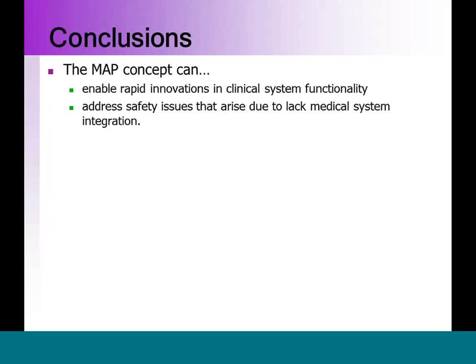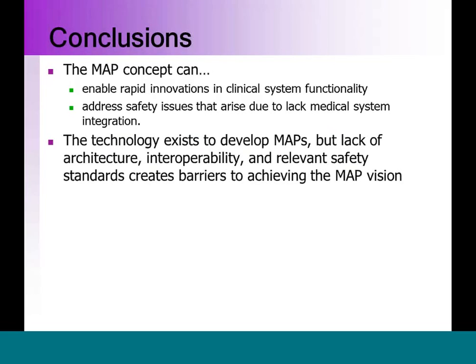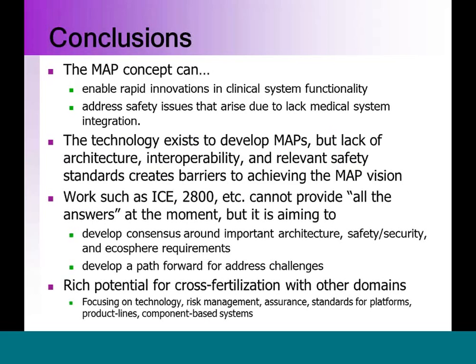But I'll just wrap up at the moment by saying what we're aiming for here is this medical application platform concept that can enable rapid innovations in clinical system functionality. You don't have to build new hardware. You don't have to come up with new displays for your hardware. Logically, you just develop your application logic as an app. It can use the same hardware that's provided and shared across multiple applications. The technology exists to build these types of systems, but really the lack of architecture, interoperability, and relevant safety standards creates barriers. Vendors just don't know how to bring these to market and navigate the regulatory process at the moment. The regulatory pathway is not clear at the moment.